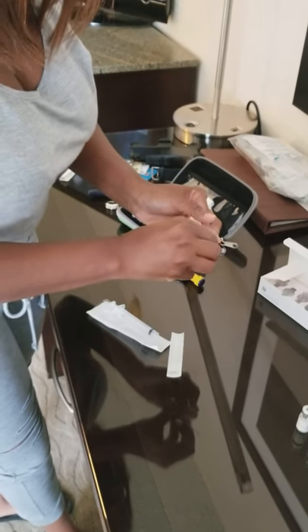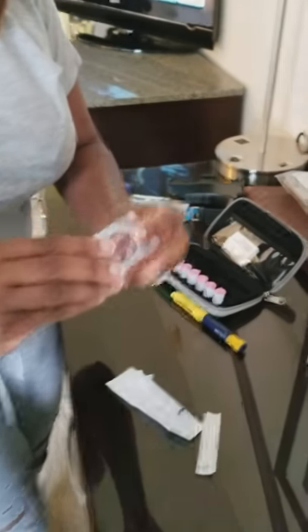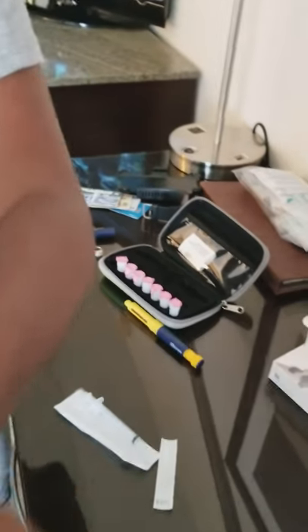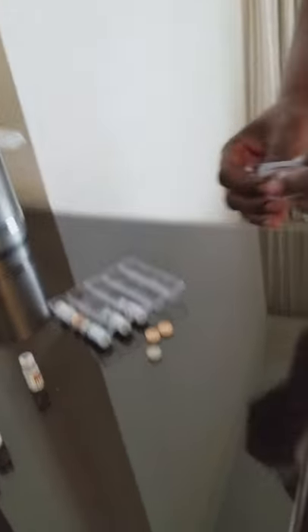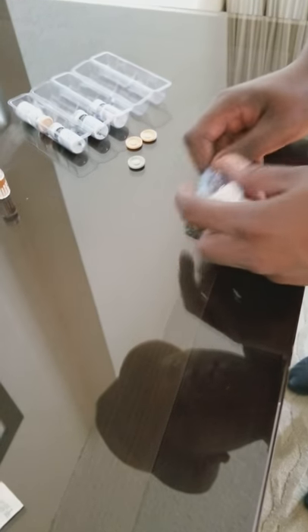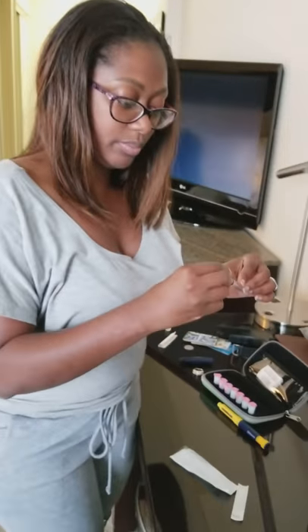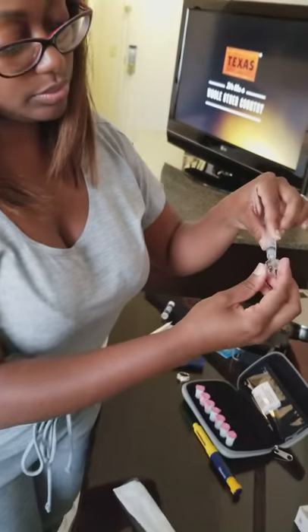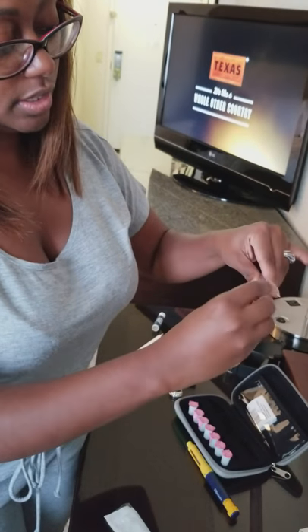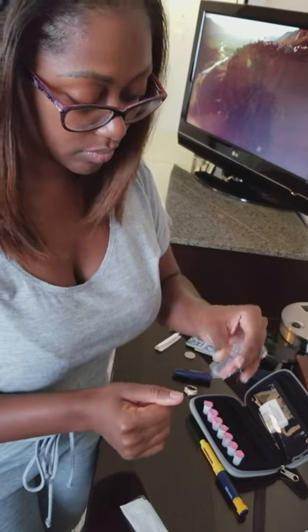You may have to help me on this. Let me see if you can grab it out — I'll take the camera. She's going to try to grab that out real quick. There you go. Thanks, babe. I got muscles! So we put the Q-cap onto the syringe. Mind you, we have to do this every night.